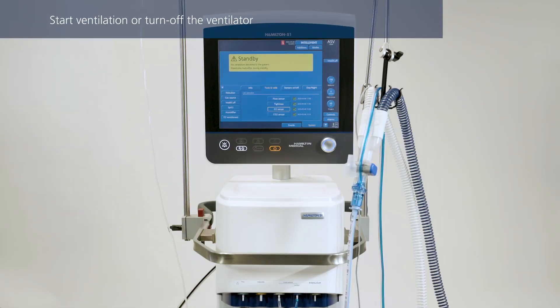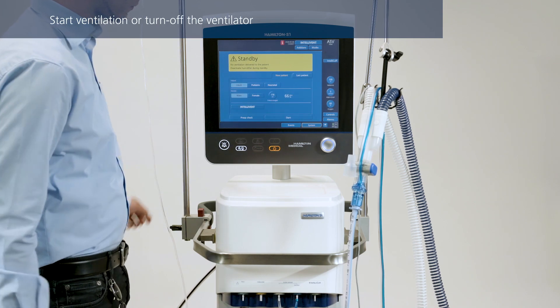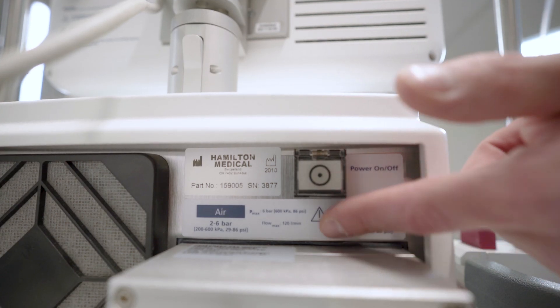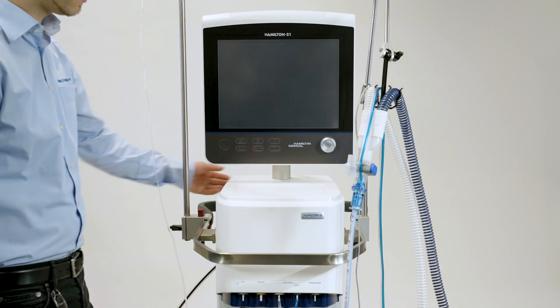Once you have completed the pre-operational checks, the ventilator is ready for use. You can set up the ventilator for a particular patient and start ventilation, or you can turn off the ventilator and keep it stored away, ready for use. All the test results of the pre-operational checks will remain stored in the memory, even when the ventilator is turned off. Make sure the setup that you calibrated is not changed or altered while the ventilator is in storage. To turn off the ventilator, press the power button at the back.